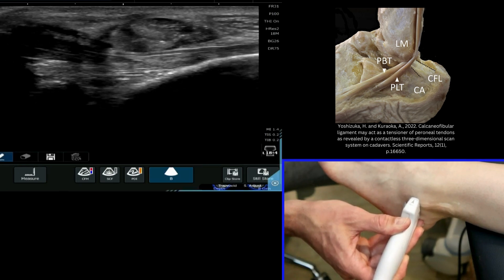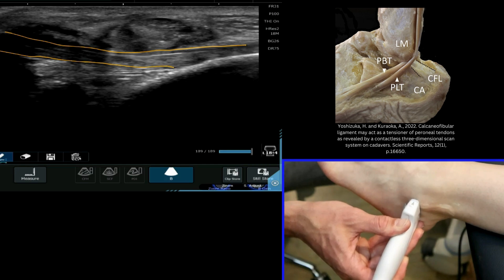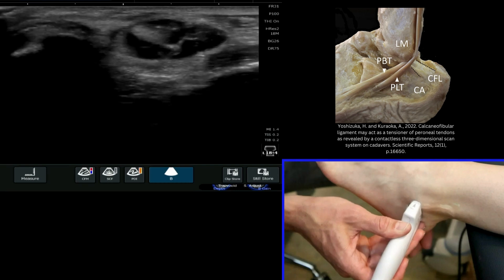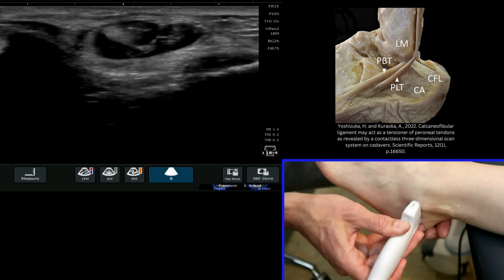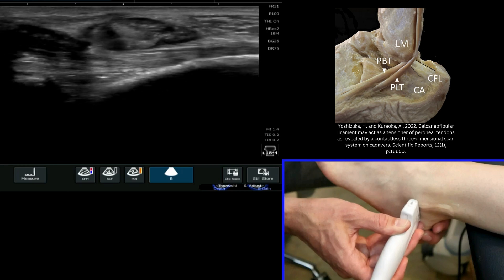We can see the calcaneo-fibular ligament coming through here, from the fibula on the left of the image, attaching onto the calcaneus here. The beauty of this position is that I can dynamically evaluate this ligament.